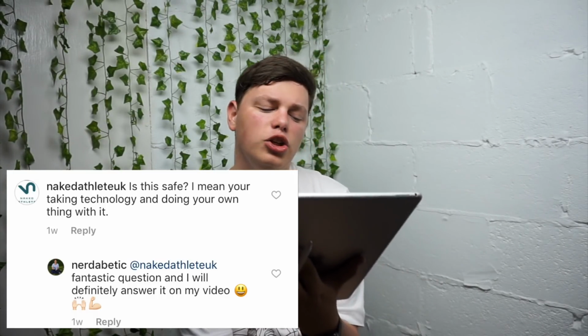And so the last advanced question is: is it safe? You're taking technology and doing your own thing with it, which is a great question that I will answer in detail in another video. I'm making a small documentary about cybersecurity of medical devices, and I've been working on it for about 6 months already, but the research for that video is taking ridiculous amounts of time. In terms of your insulin pump, using it for looping doesn't expose it to any additional hacking or wireless hack risk. It is just as secure as using your pump for your normal day-to-day management.